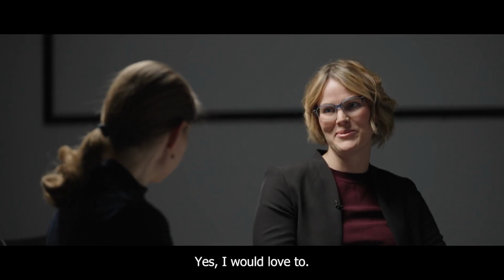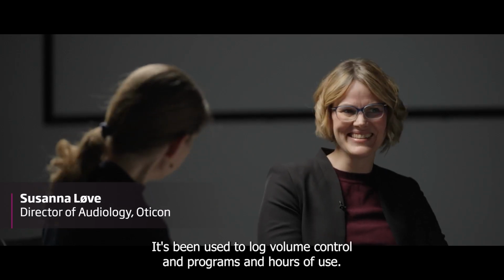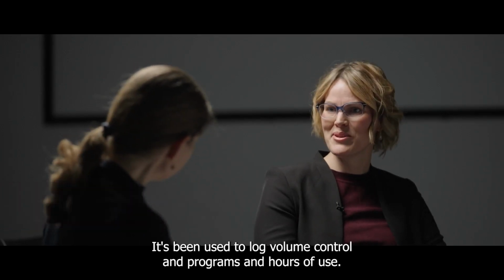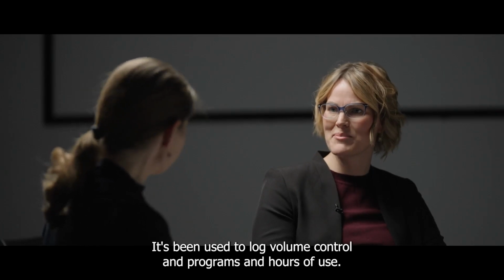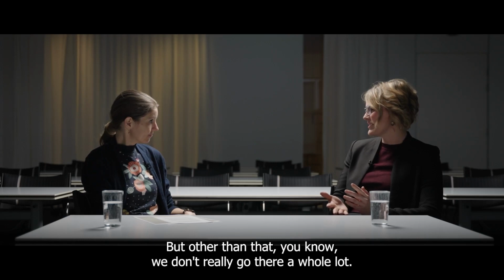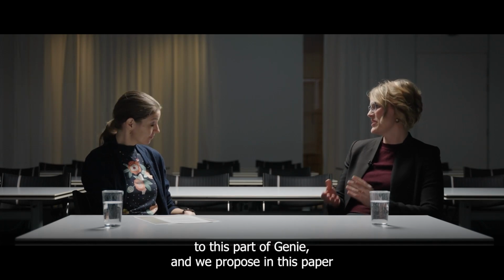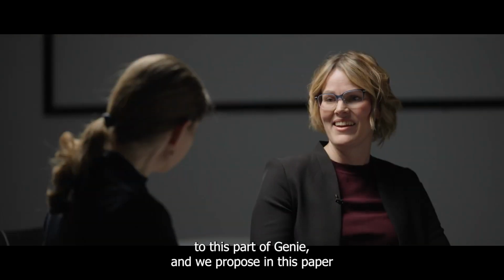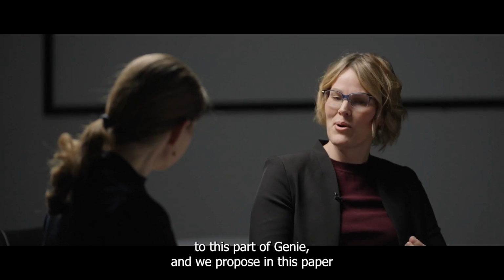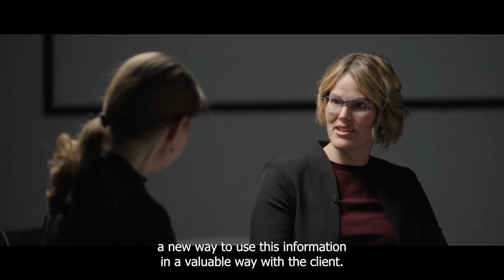Yes, I would love to. Data logging isn't really something we bring up a whole lot, right? It's been used to log volume control and programs and hours of use. But other than that, we don't really go there a whole lot. And what's new this time is we have added so much value to this part of Genie. And we propose in this paper a new way to use this information in a valuable way with the client.